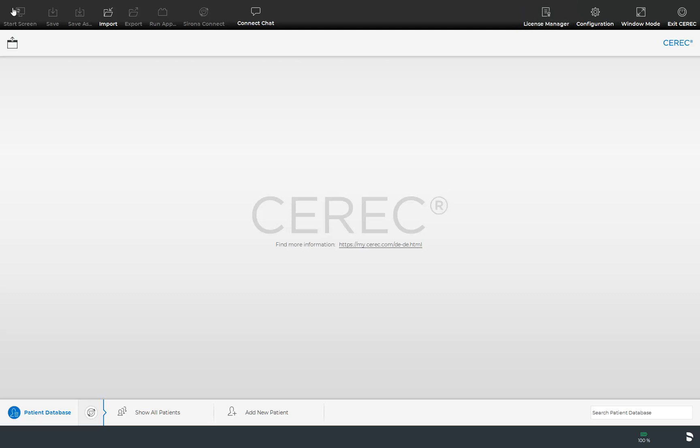On the far right the Exit CEREC button is displayed which closes the CEREC software. Please make sure to first save the currently open case before closing the software.